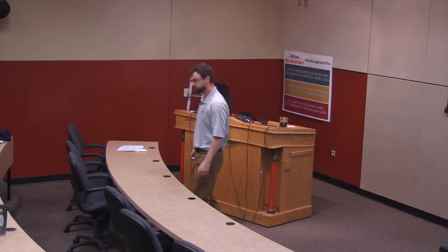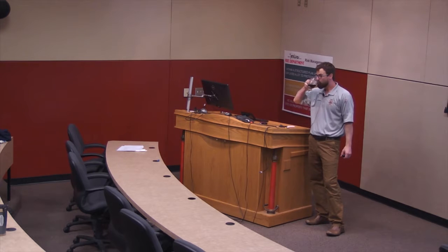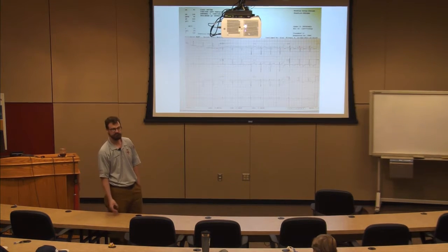Make sense? Yeah. I had something very similar a week after class, and they said it was the same thing, where she had just had an antibiotic prescribed to her and she was on antidepressants. And I was told later that that's a certain combination that causes the long QT, the torsades.